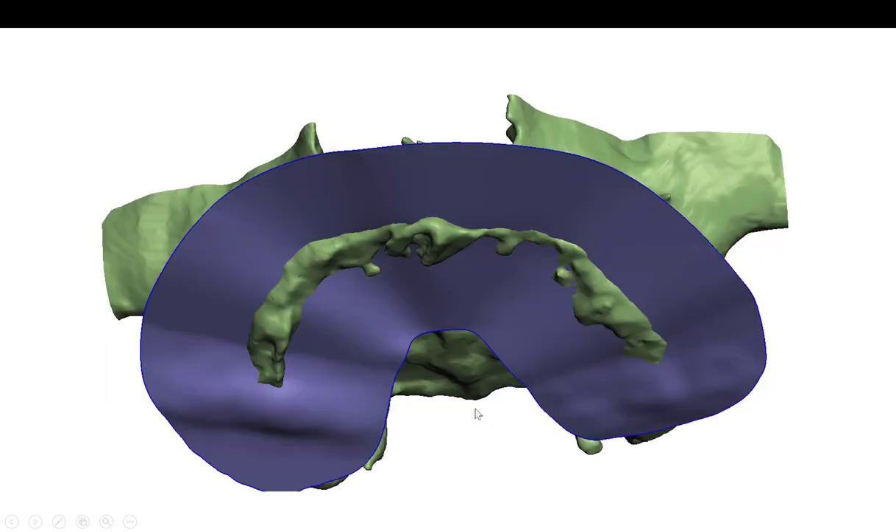This is the plane of reduction. It's not a lot of reduction. In fact, just to do that amount of reduction alone really doesn't warrant a reduction guide. However, we're going to do a reduction guide simply because it serves as the foundation for you to then put your drill guide on and then to index your temp. So it's just the way that we're going to approach this case as opposed to swappable guides.